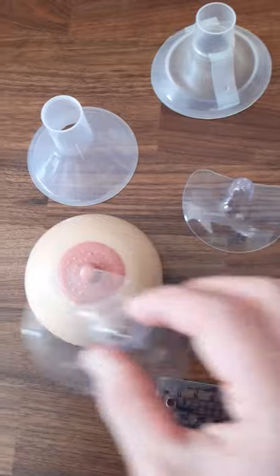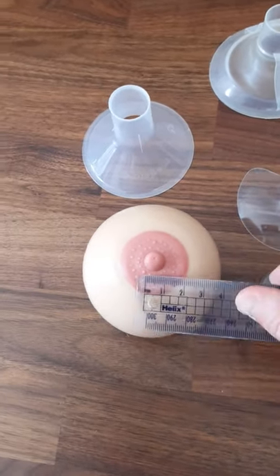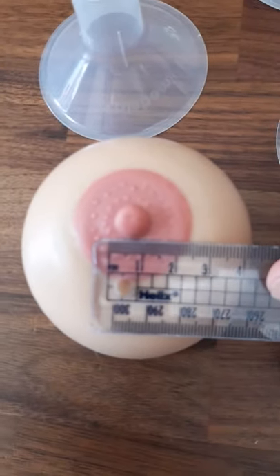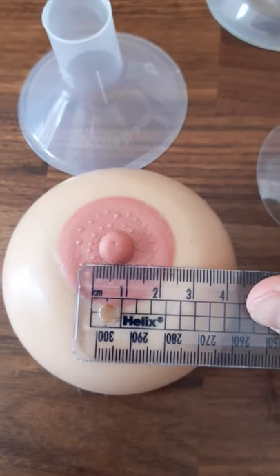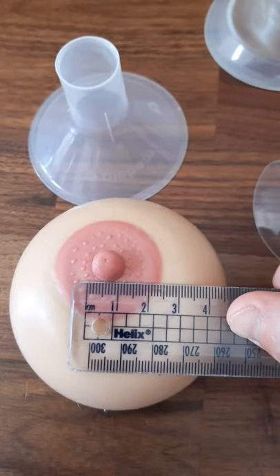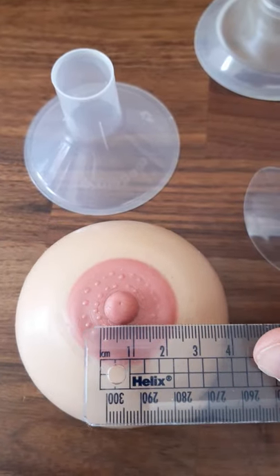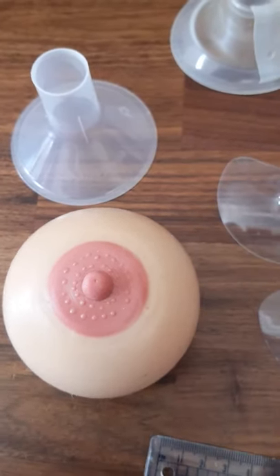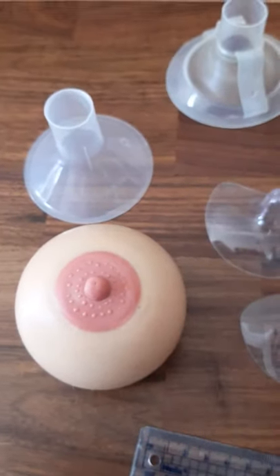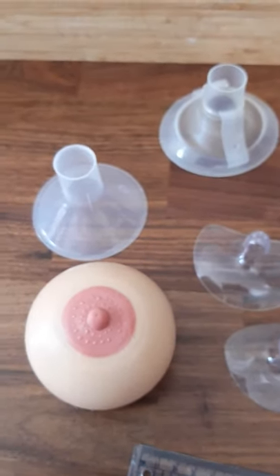The same goes for nipple shields, but there is another way without trying different sizes. Simply take a tape measure or ruler and measure across the length of your nipple in millimeters, then add four millimeters — that will determine the size of the shield you require. For example, if you get 17 millimeters, plus four millimeters is 21 millimeters, so you require a 21 millimeter shield. If that exact size is not available, simply go ahead and take the next size up.